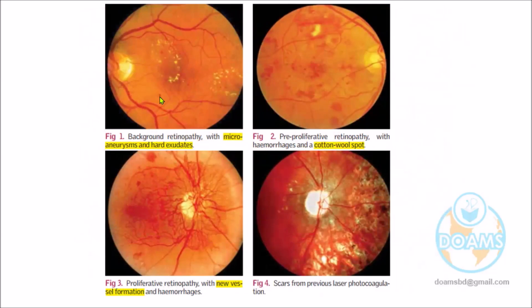You see, hemorrhages are there. And if it is associated with the capillaries or the smaller arteriole, you can tell that it will be microaneurysm. And here you see more dot and blot hemorrhages, including a cotton wool spot. We discussed the cotton wool spot in the hypertensive patient, but it may be present in a diabetic patient also. And remember, in real life, a patient has diabetes and this patient has hypertension altogether. This is a very common scenario. So what does it mean? You will get the pictures of both diabetic retina as well as hypertensive retina. Anyway, we are learning now, in this picture especially, the diabetic retina in isolation.